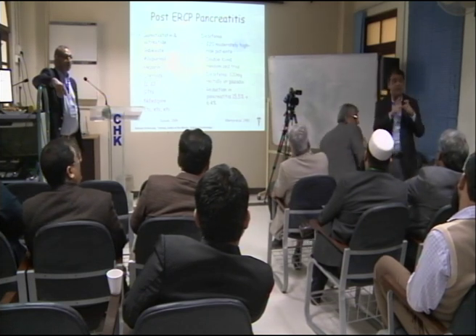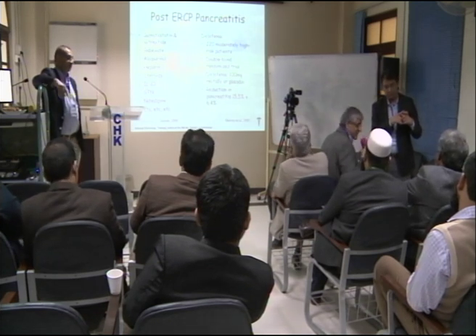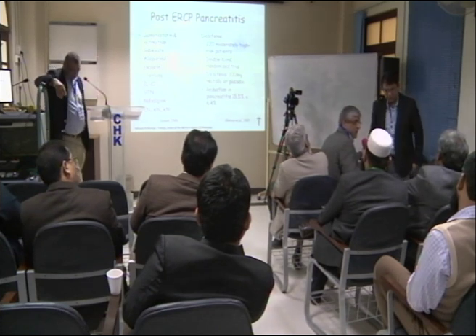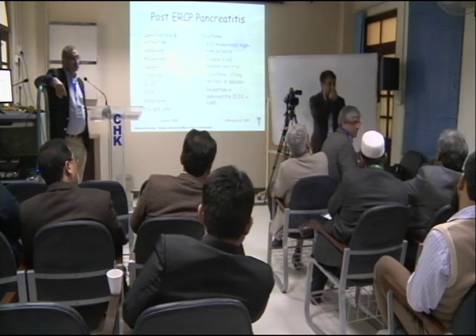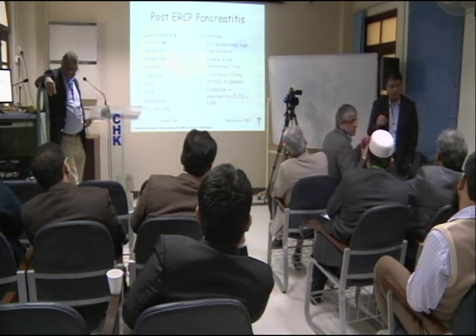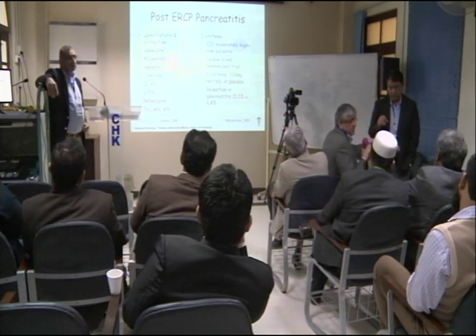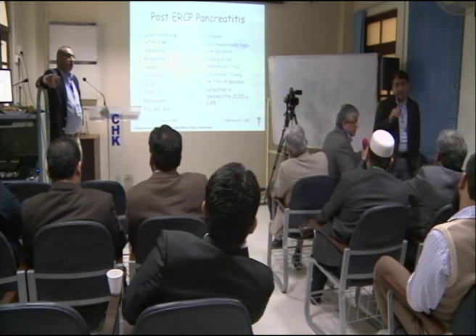Yes. I do not use straight stents when trying to prevent pancreatitis because I have seen a nasty migration in a young doctor from another province, and she's now got chronic pancreatitis because of trying to prevent pancreatitis. So a straight stent, if you want to put it, make sure the flange is not there. The idea is that the stent should not go in. If the pancreatic stent goes in, it's a nightmare to take it out. We always use a pigtail.